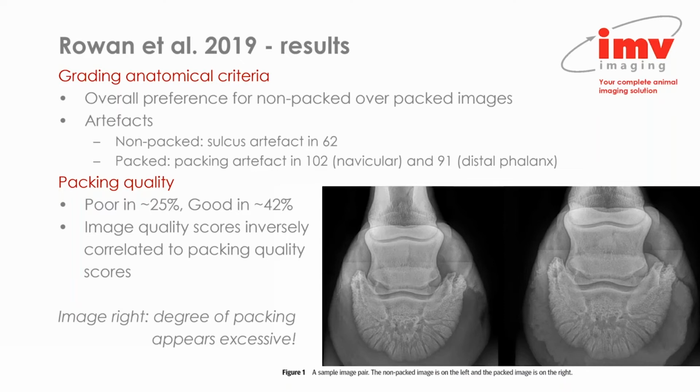Now, very interestingly, the packing quality was graded as poor in 1/4 of the horses and good in only 42%, so less than half had good packing quality.